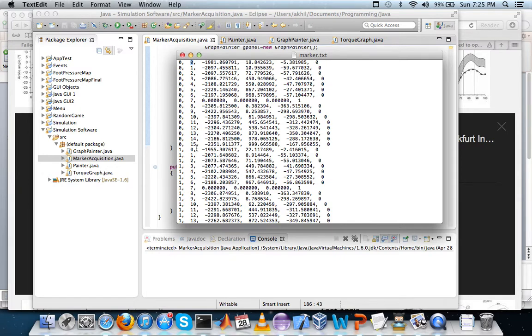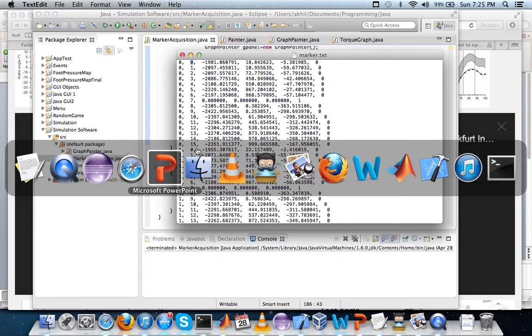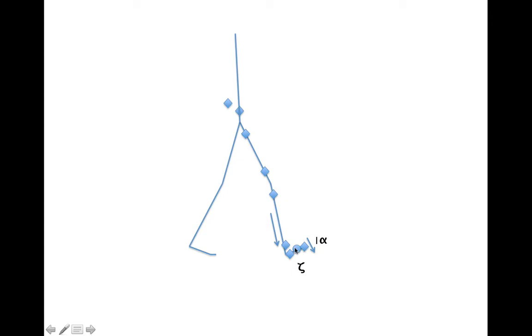Just to show you a little more accurately exactly where these LEDs are, the 0th and 1st are on the foot, right there. The 2nd and 3rd are on the calf. The 4th and 5th are on the thigh. The 5th, 6th is at the hip, and the last one's at the back. And of course, the left leg has a similar placement of LEDs.